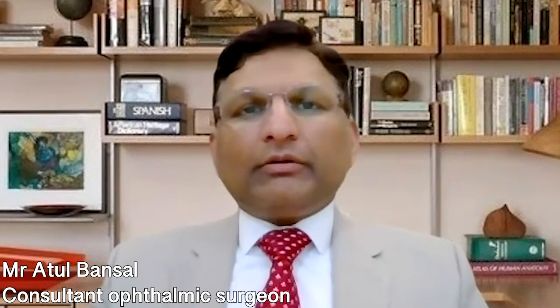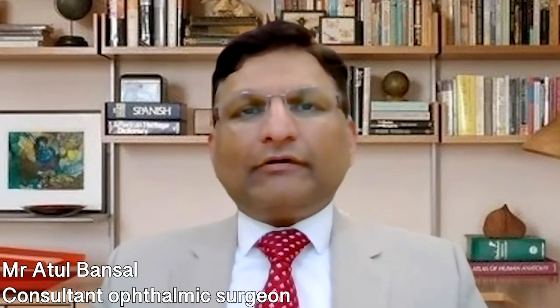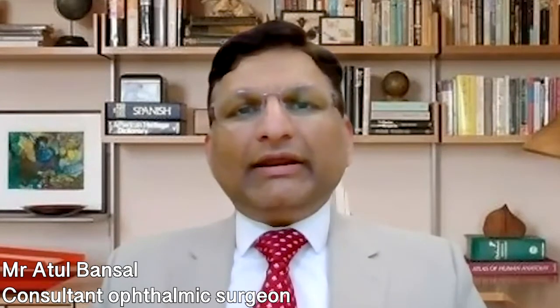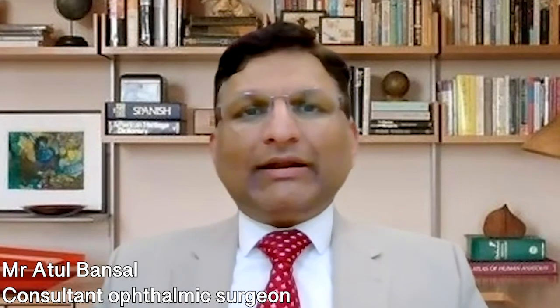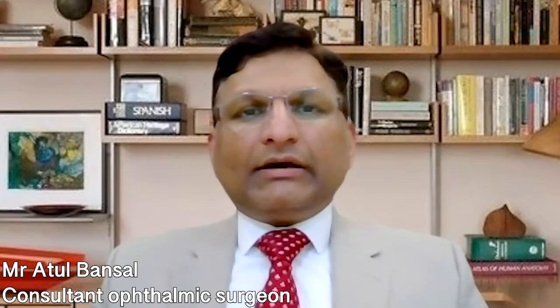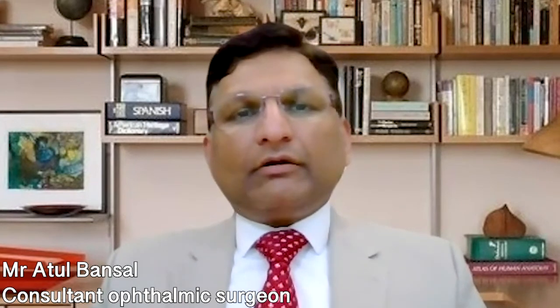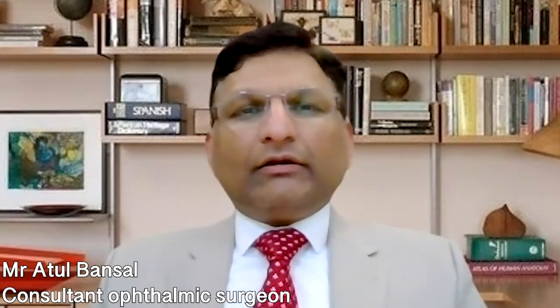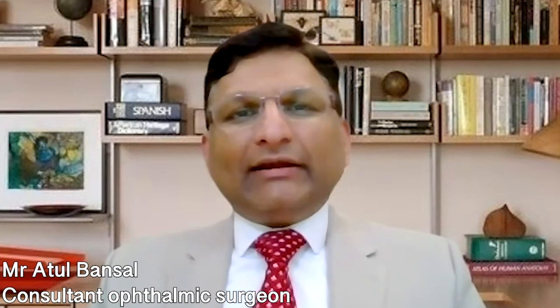YAG laser iridotomy is slightly different because it's done for acute angle closure glaucoma. In those cases, the recovery could be slightly longer, but in routine cases of narrow angle, again, the patient is expected to start their normal activities from the next day, fully, including driving, and on the same day for most of their activities as well. Cyclodiode laser, a slightly longer period.